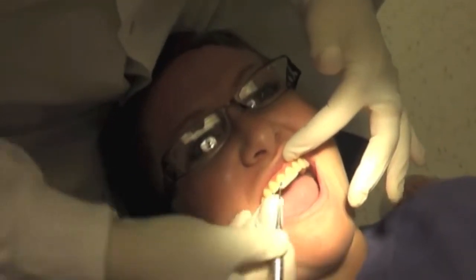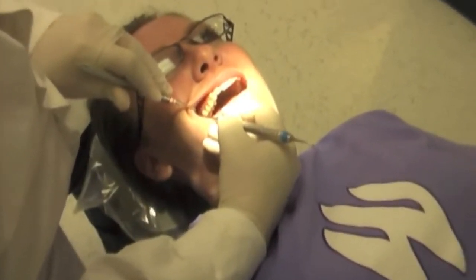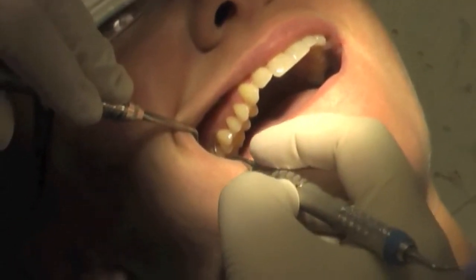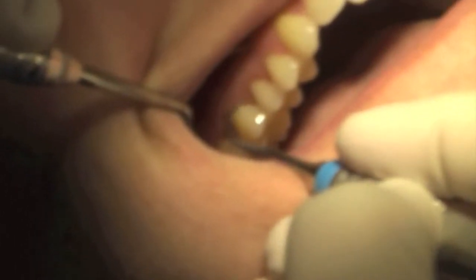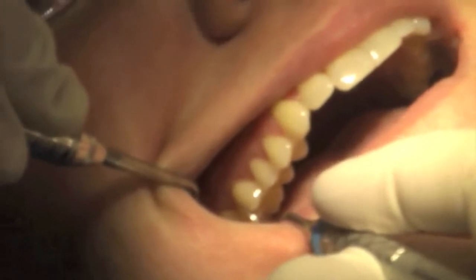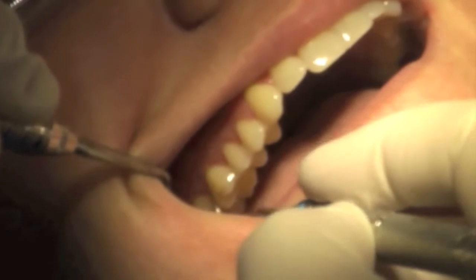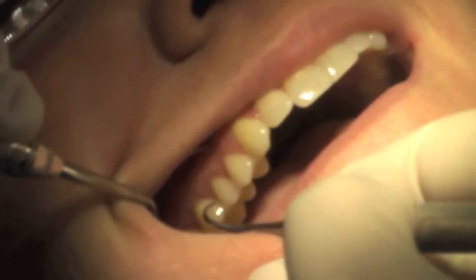You want to make sure your angle is correct — you can't be flat on your fulcrum. Same thing in a posterior area. As far as angulation, you want to make sure that your angle keeps that toe third in touch with the tooth. If I'm back here angled like this, that toe third is going to go right into the gum. So I want to make sure I'm connected, connected, connected at all times to the side of that tooth. Even if you have to practice above the gum line — if the instrument's sticking out into the gum line, that's going to be painful. So keep that toe third — just walk it around — and do whatever you have to do to keep it in total contact with the tooth at all times.